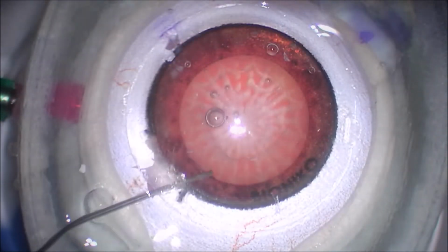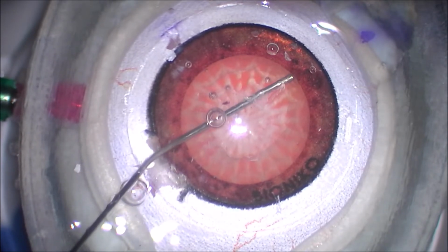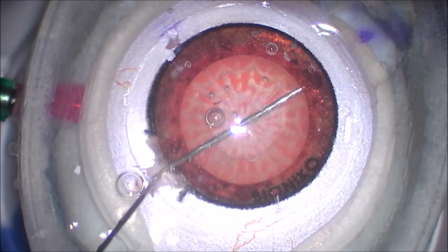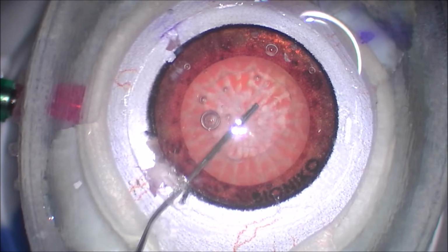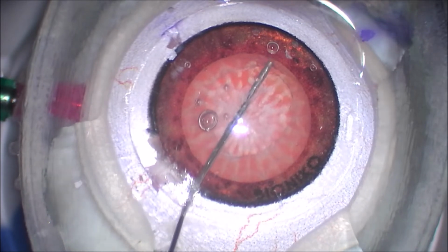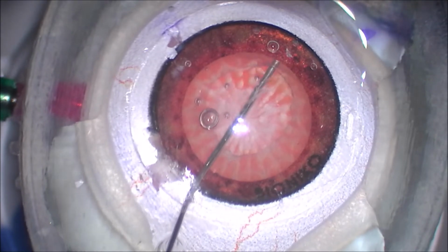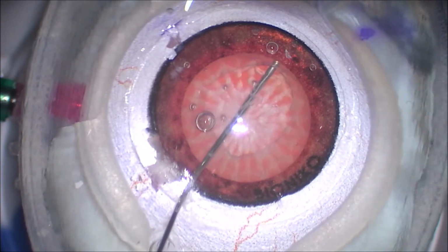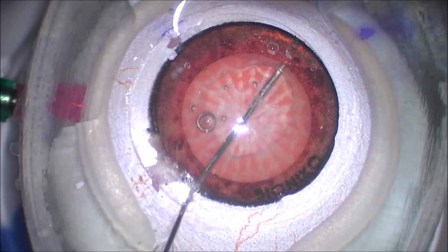And so now she's going to use a blunt tip cannula to try to hydrodissect. She gets the cannula under the rexis edge as far as she can, and then she starts pushing BSS. We did not really see a fluid wave as she did this, and she's going around picking different places to get that wave. But again, I didn't really appreciate much of a wave as she did this maneuver. You will see in a future case where I'm actually doing the cataract surgery myself, and I'll be able to share with you my first-hand experience with this particular model.